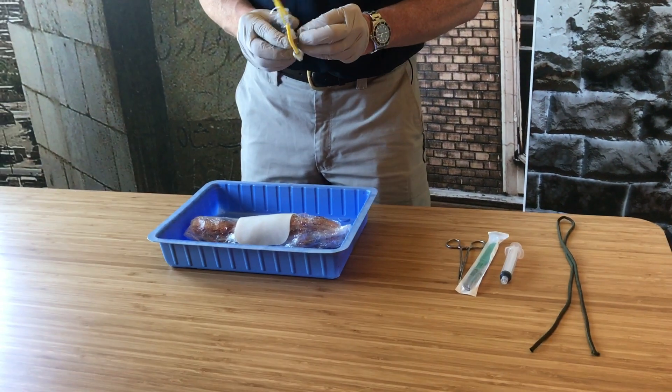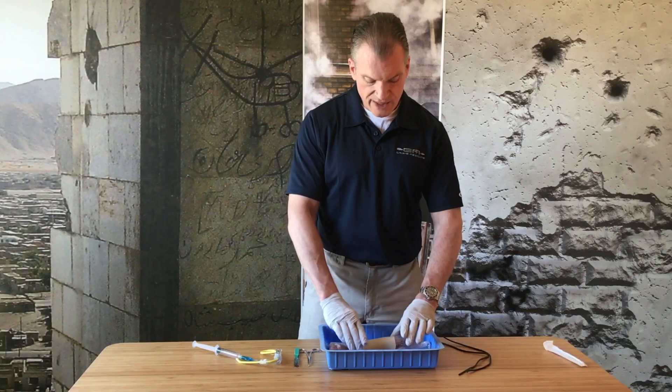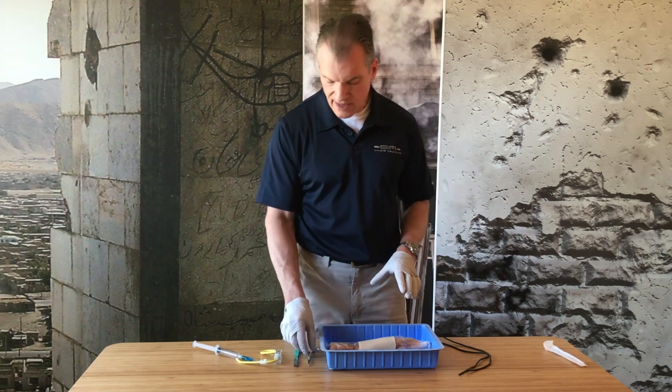Let's use this NAR tracheostomy tube with the preloaded bougie for a surgical airway here. Pig trachea. I'm at the right side of the casualty, head and feet down to the side.